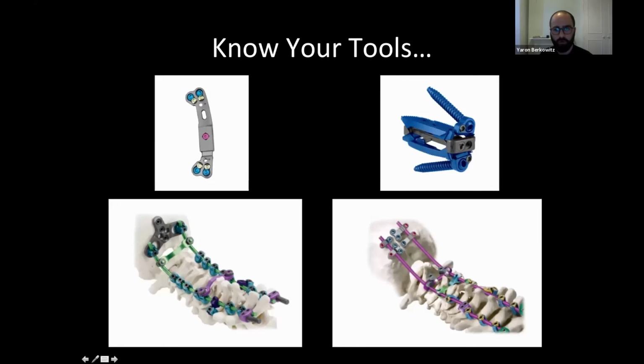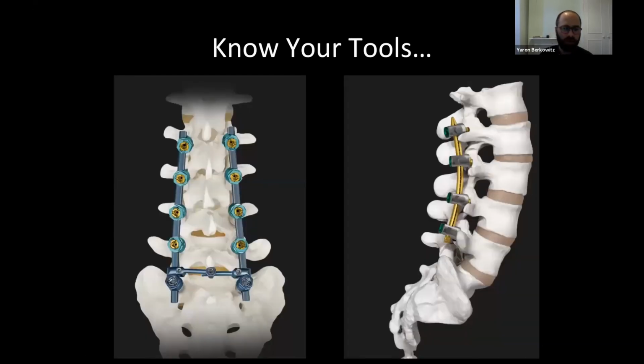Dick on the previous talk. So she went through that in more detail. And in the lumbar spine, again, you've got these screws that are going into the pedicle. That's going to be coming through here into the vertebral body. Too high, and you potentially impinge the exiting nerve root of the one above or of the level below, and then medial and lateral.